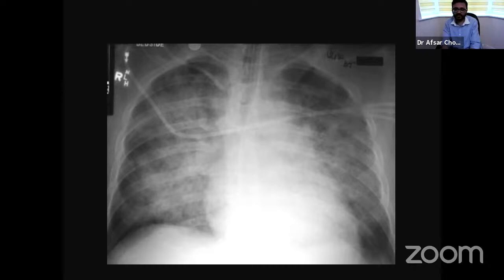So I always say, if a hilum looks abnormal, even if two people say that this is fine, but someone says no, there could be a doubt, then I'll go with the doubt. Because of the specificity of findings on a chest X-ray, especially in those areas. So you don't want to miss a cancer there. So you should go ahead with the CT in those cases. So I have a low threshold to accept CT scans in those clinical settings.